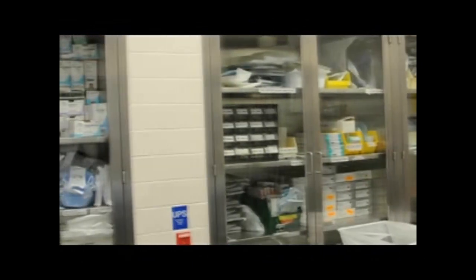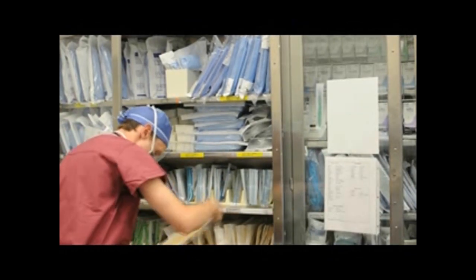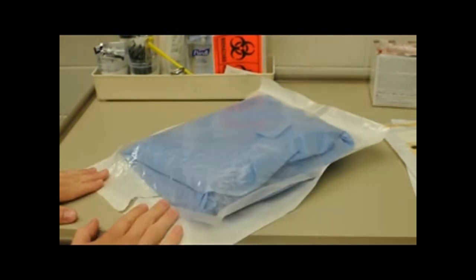Gowns and gloves are located in the cabinets along the walls of the OR, so grab a gown and two pairs of gloves — one pair for under glove and one pair for over glove. You'll be sized for these at your surgery orientation. Now comes your first real test in the OR: handing your gloves and gown to the scrub tech in a sterile manner.